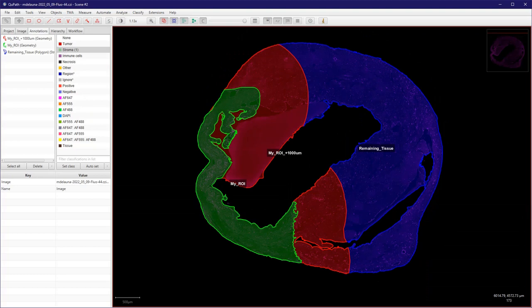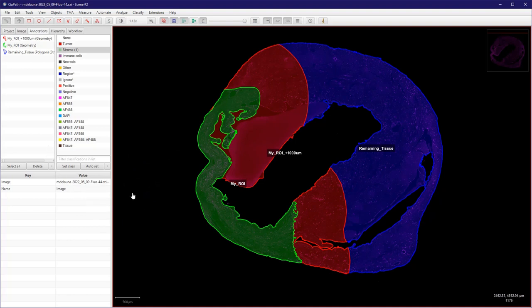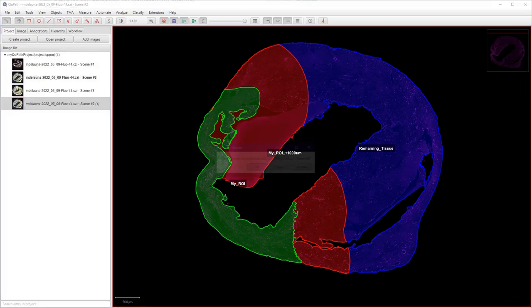Hello, welcome to this tutorial. I will show you today how to use QuPath to define regions using brushes and do a bit of annotation arithmetic to create those regions that you can see here in red and in blue, which are actually derived from the first green region. In order to do that, let's move to another image like here.